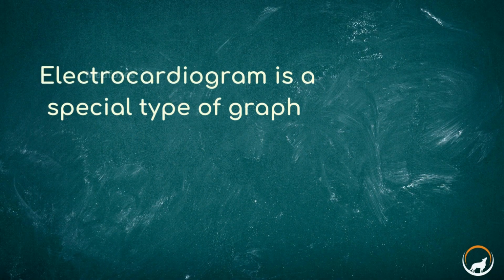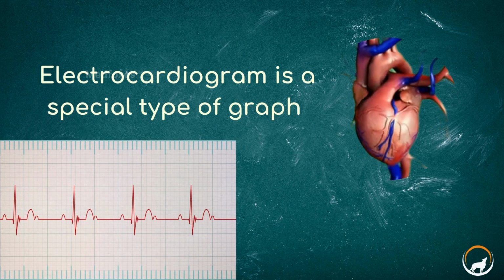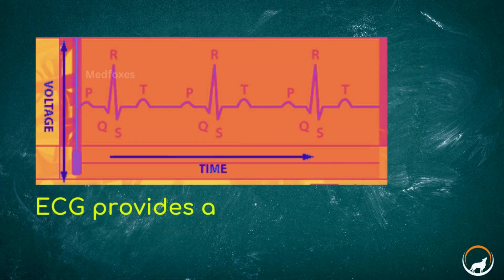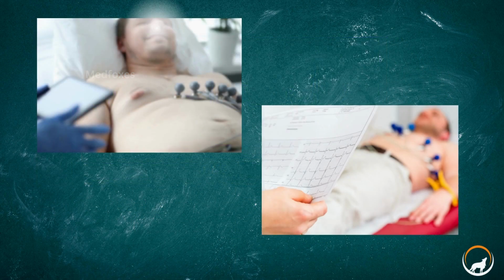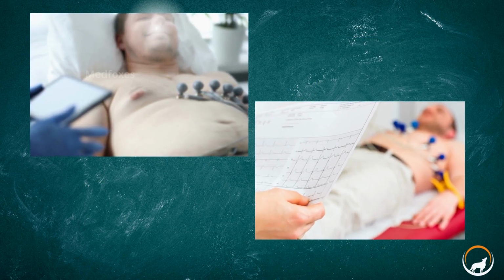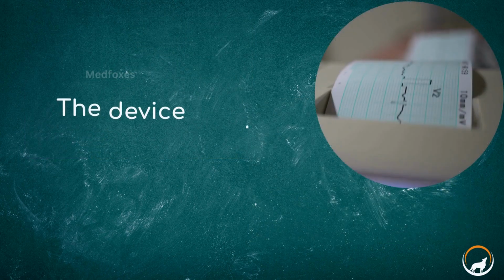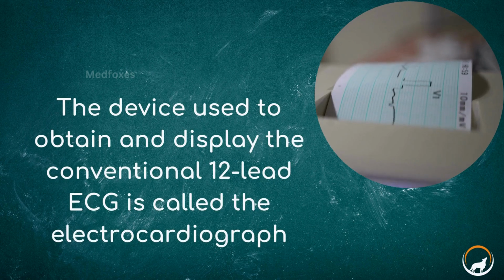The electrocardiogram is a special graph, representing cardiac electrical activity from one instant to the next. Specifically, the ECG provides a time voltage chart of the heartbeat. The ECG is a key component of clinical diagnosis and management of inpatients and outpatients because it may provide critical information.